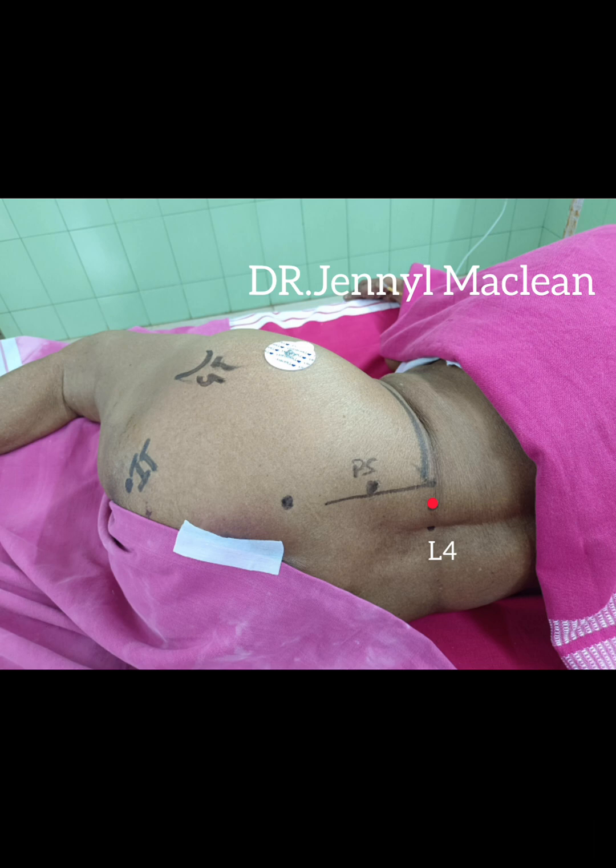What is Capdevila's Approach? The spinous process of L4 is identified. A line is drawn from the center of L4 spinous process laterally to intersect with the line that passes through the posterior superior iliac spine, parallel to the vertebral column on the side to be blocked. The puncture point is at the junction of the lateral one-third and the medial two-thirds of that line.